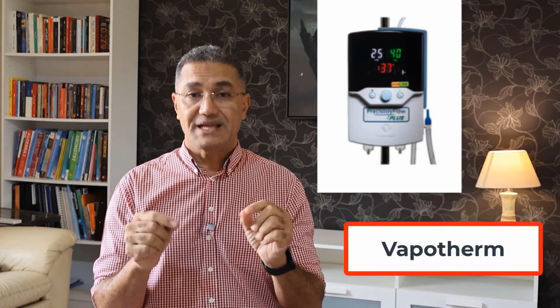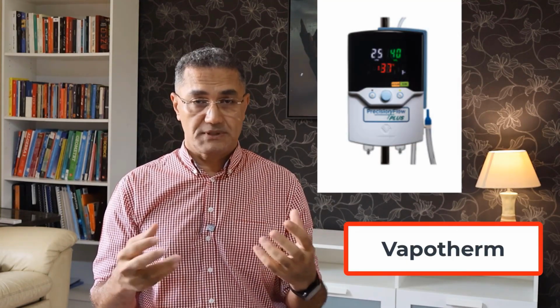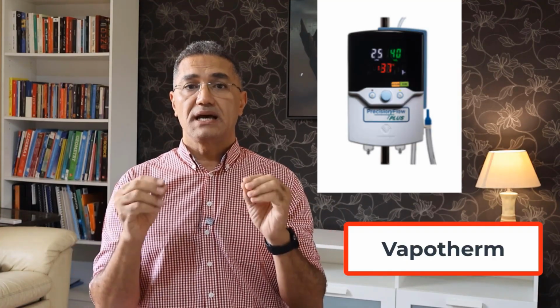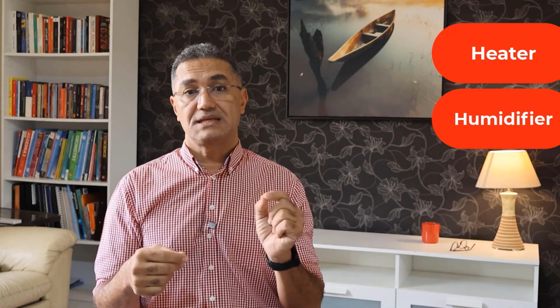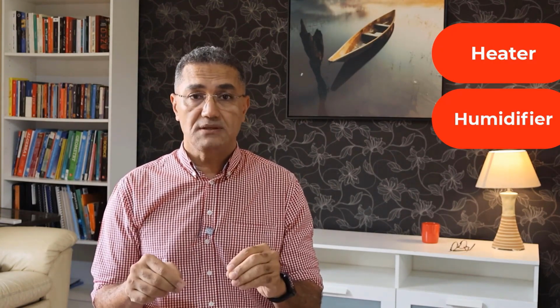The first thing is that when you apply any type of respiratory support to the patient, you must have a very clear statement. Any respiratory support you provide to the patient is essential. Whatever the machine is, and whatever its category or type, it must have three very important things. The first thing it absolutely must have is a heater in order to make the air suitable for the right temperature. Secondly, there should be a humidifier to make the air suitable for inhalation, because if you give it without one, the dry air will cause problems for the mucous membranes and the cilia present in the airways. So you should never give a patient respiratory support with any machine without these considerations.